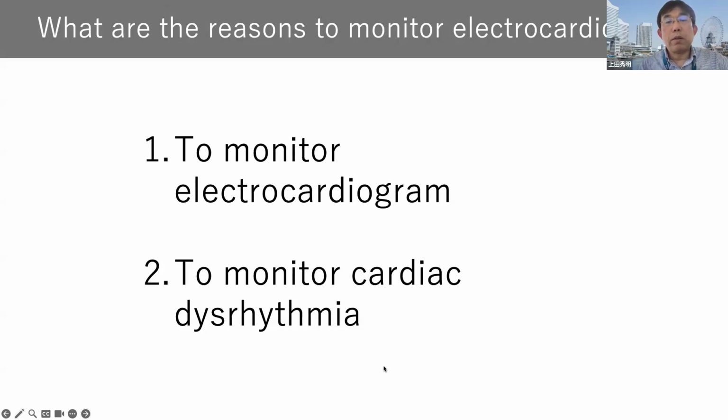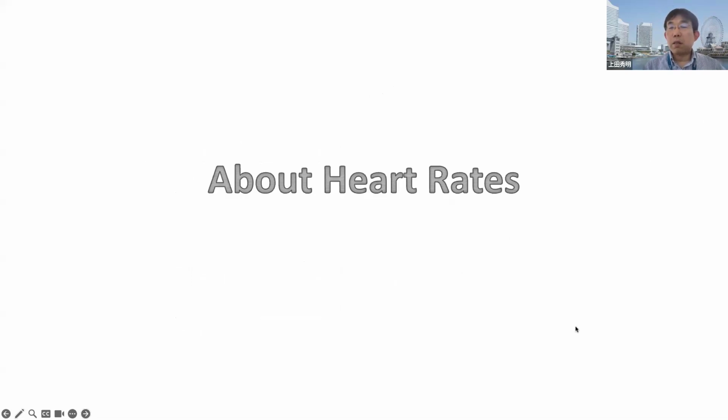So what are the reasons to monitor ECGs? The main reason is to monitor the electrocardiogram and to understand cardiac arrhythmias. And let's talk about the heart rate.